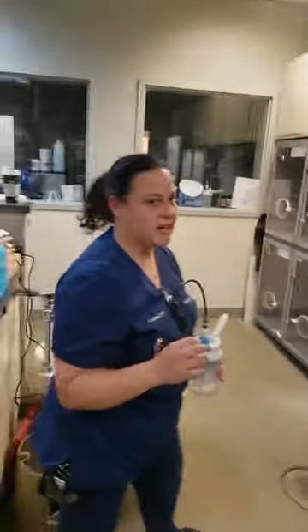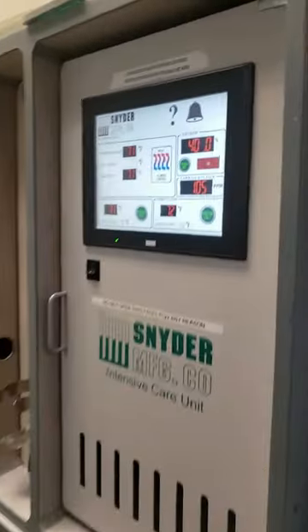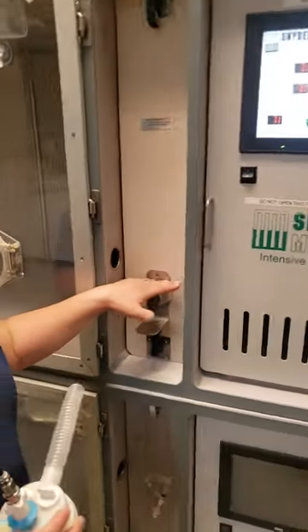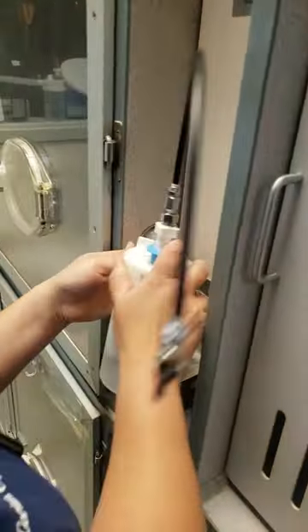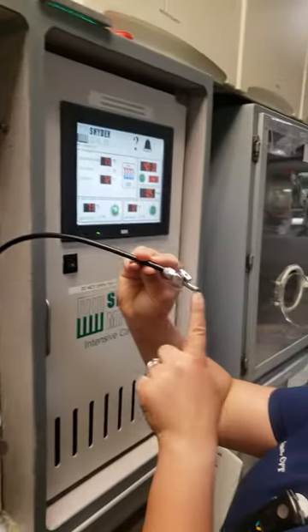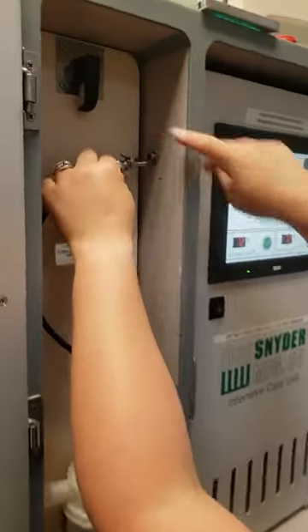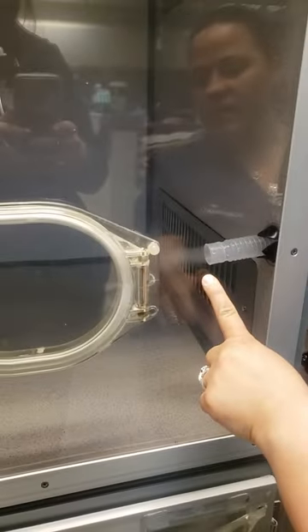For the oxygen cage, you want to make sure that your oxygen cage is already at 40 percent because we're going to be turning the oxygen cage off. The cages have a holder for the nebulizer. We're going to stick the tube into the oxygen cage port. It holds the canister right here, and then we're going to take the other part of our connector and just stick it into this hole right here and it clicks in.